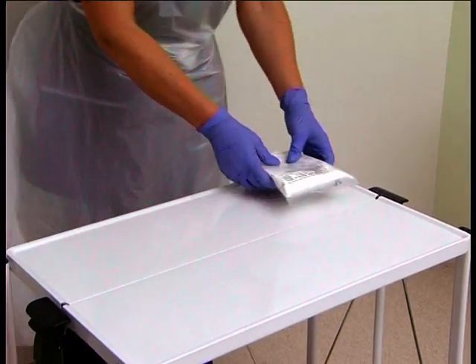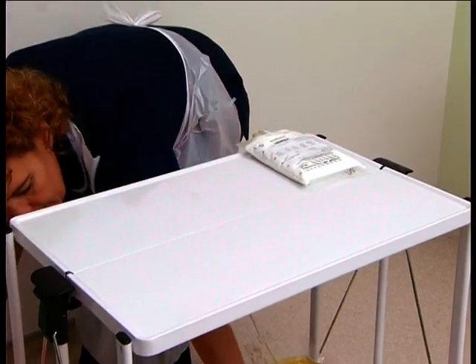Place the bag containing the fat infusion on the trolley with the connection ports facing towards you.